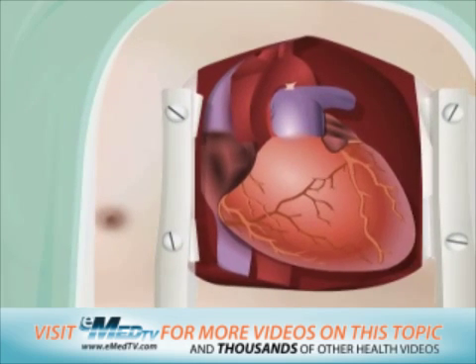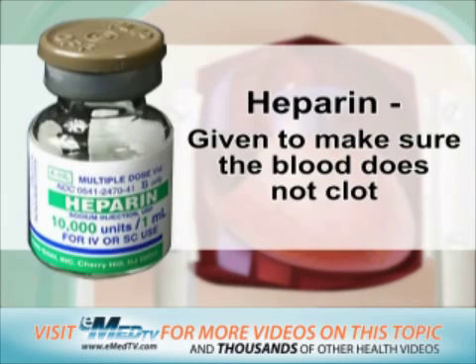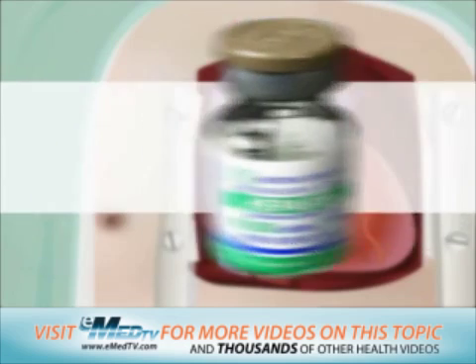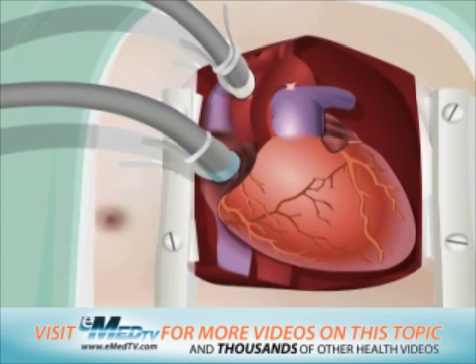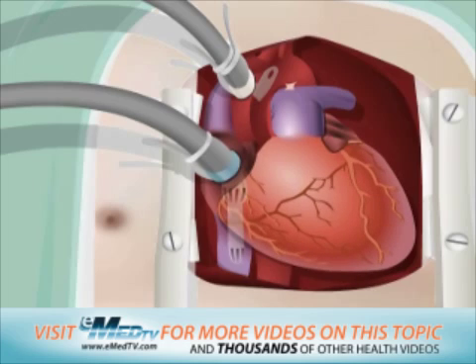At this point, a blood thinning medicine called heparin will be given to make sure that the blood does not clot. The surgeon will then connect the heart to the heart-lung bypass machine with a plastic tube. Blood from the heart is then sent to the bypass machine through this tube. The machine supplies the blood with oxygen and then pumps it back to the rest of the body.